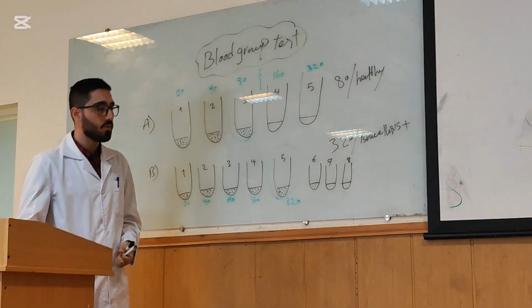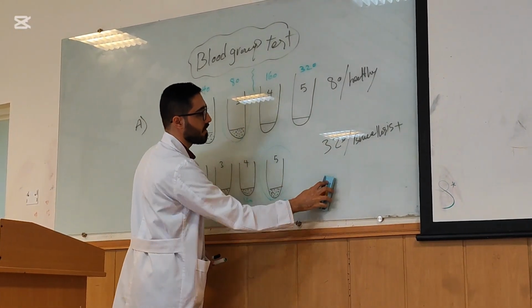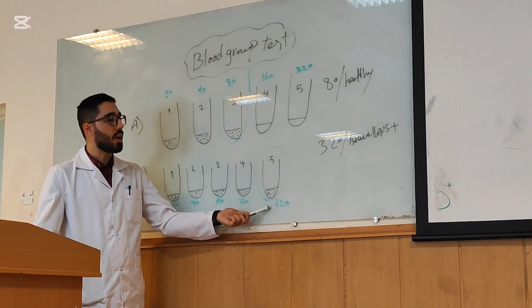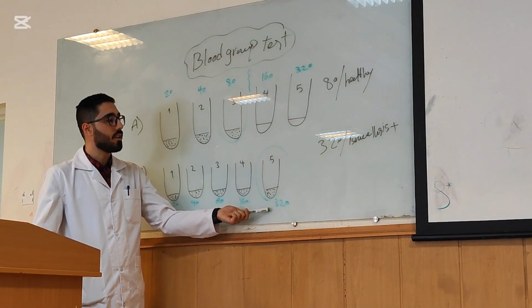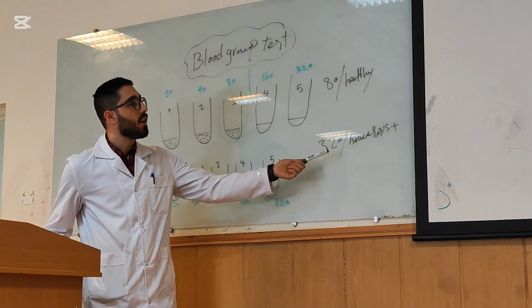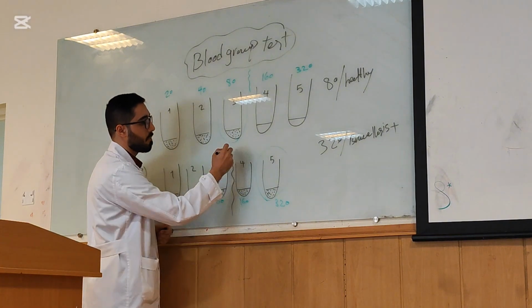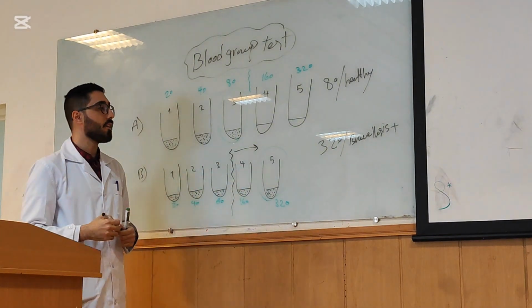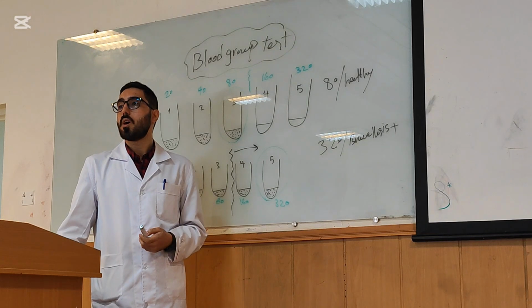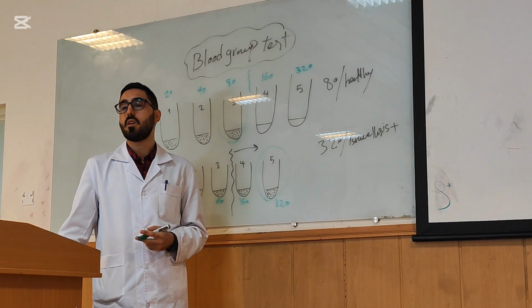But for you, forget that and just focus on 5 tubes. This is your last tube with weak agglutination. The titer of the test is 320, and because it is past the borderline, we call it positive, and my patient has brucellosis. Okay?